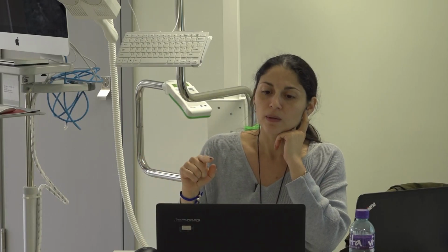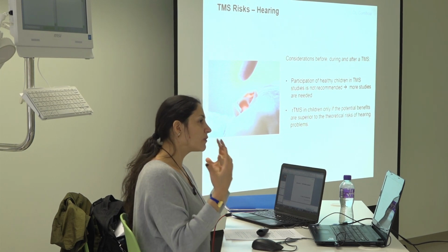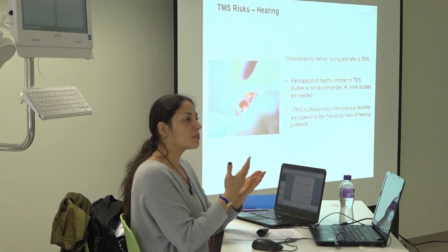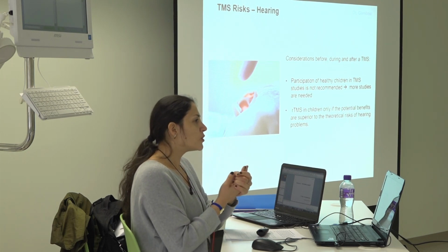We don't know, and as we don't know, you should not do it. rTMS is actually quite delicate because the brain of the child is really in development, and rTMS is modulating. You're applying a stimulation for 15, 20, 30 minutes. You don't know what you are doing, and the brain of the child is not completely formed yet.